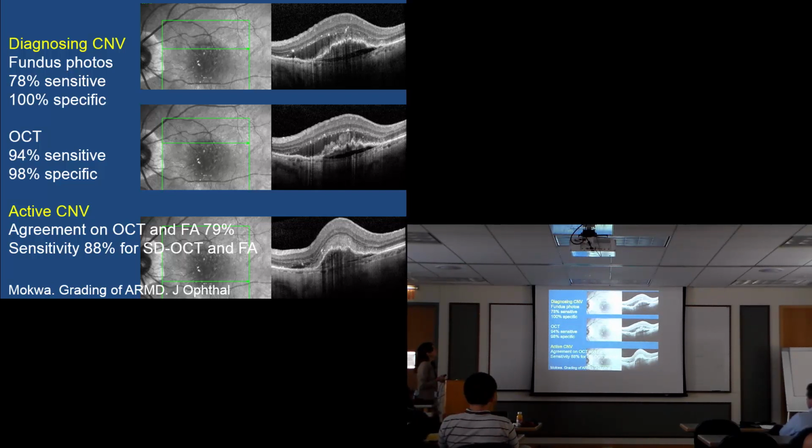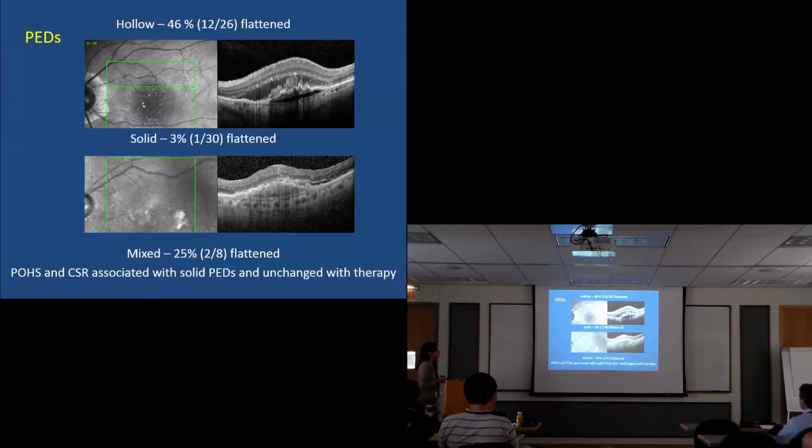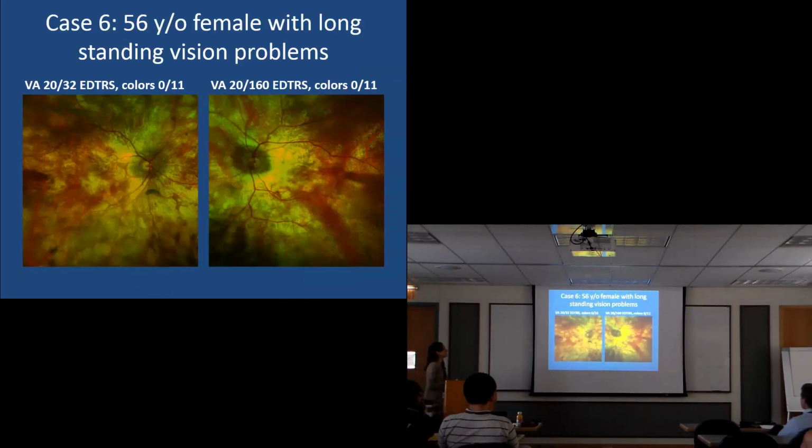So fundus photos in diagnosing this leaking, they get very good specificity, and not here as much. And I think it's because sometimes we're not sure if it's solid and inactive, or is it active because it has this fluid cleft. These are terms that are developing now. And this is where we get all these numbers from. So this is where we need your help to make things better.